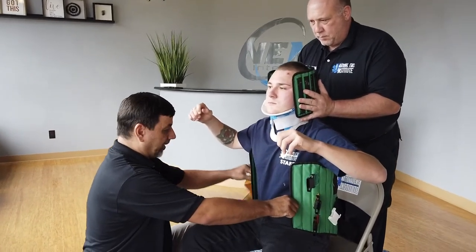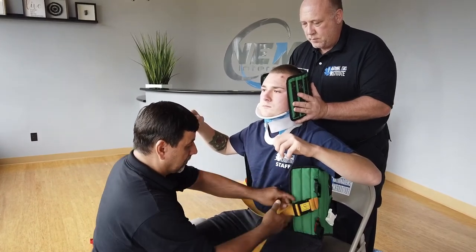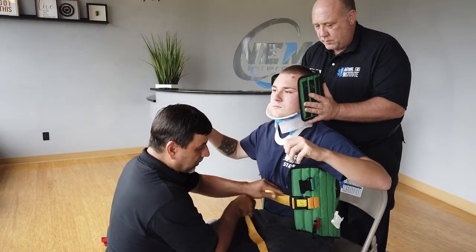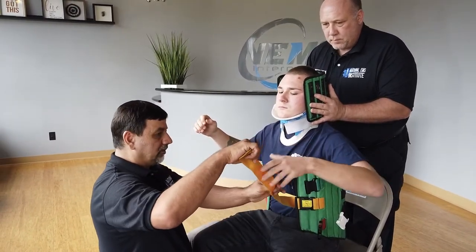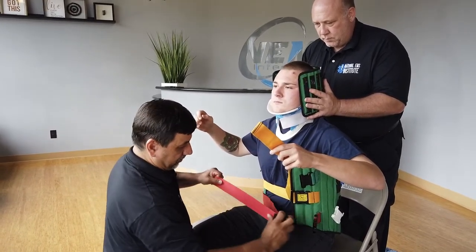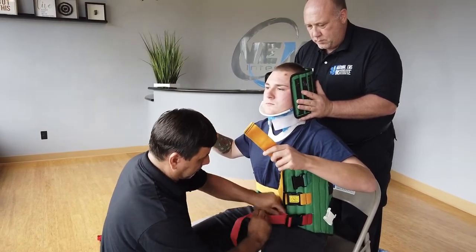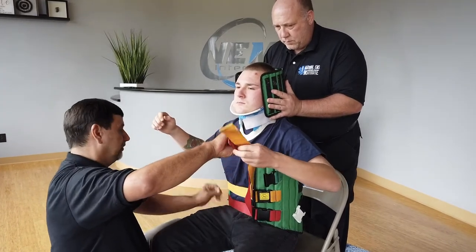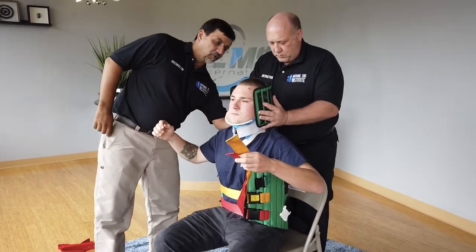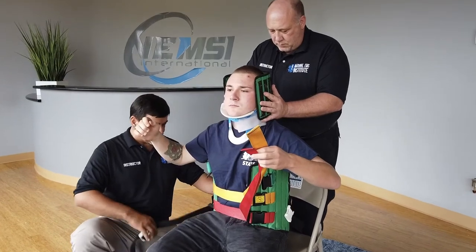I will then start doing the strapping. We are going to use the middle strap first. Make sure none of the straps are tangled. You are going to feed and pull so we are not having excess movement. The bottom strap will be the next strap in place. Now we are going to feed the leg straps in. With the leg straps we are going to have to put them from the back end to make sure the straps are not twisted or kinked.